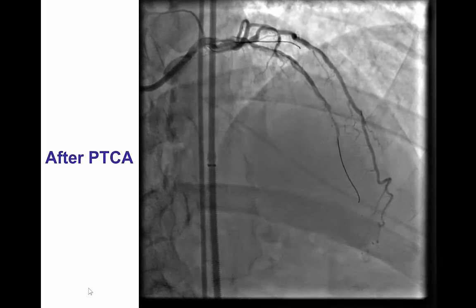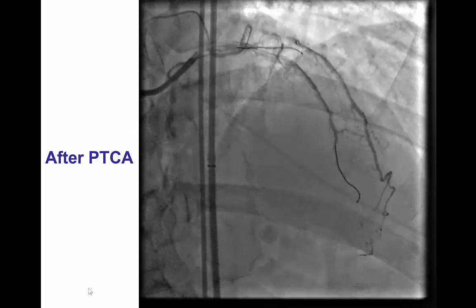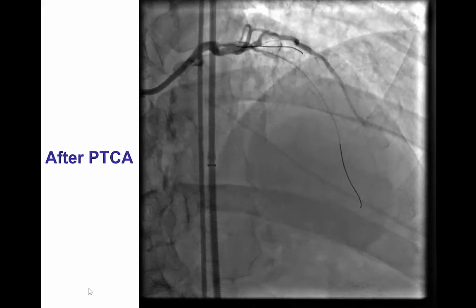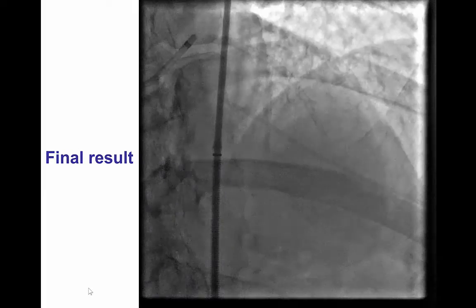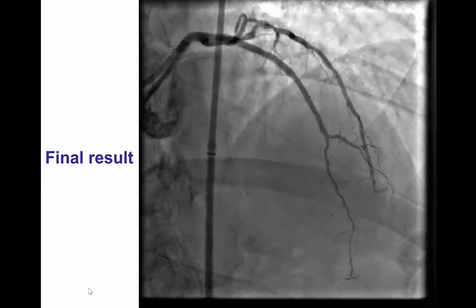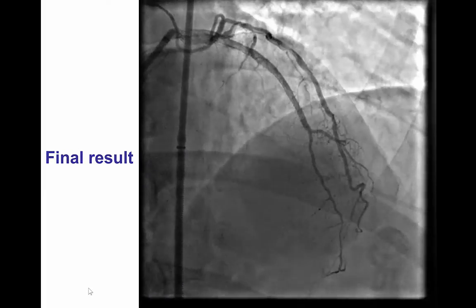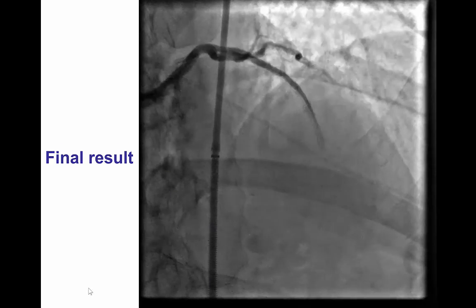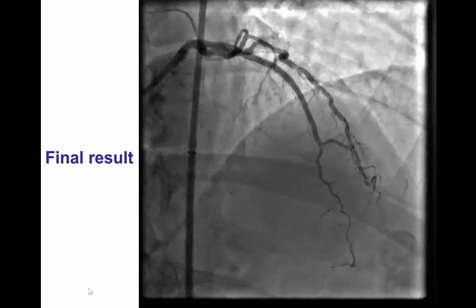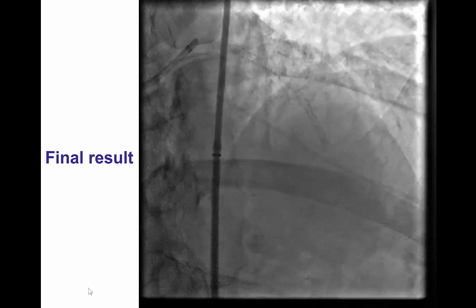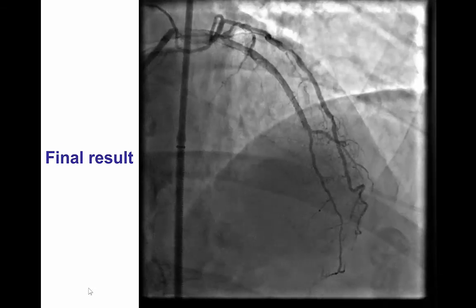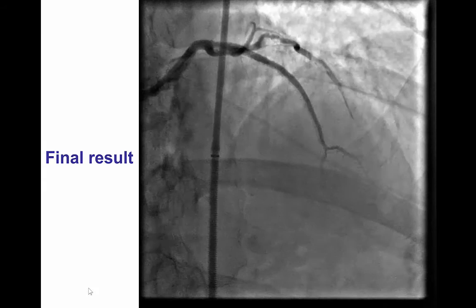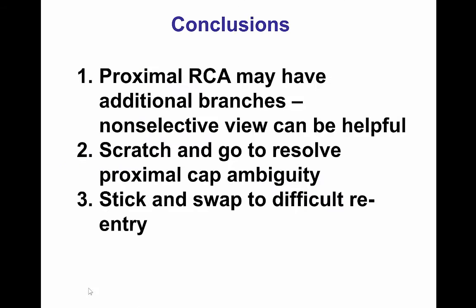Therefore, after pre-dilatation, we did confirm that we were indeed into the distal left anterior descending artery. After implantation of two stents, there was a nice final angiographic result with TIMI flow into the LAD, and the patient had an uneventful recovery.